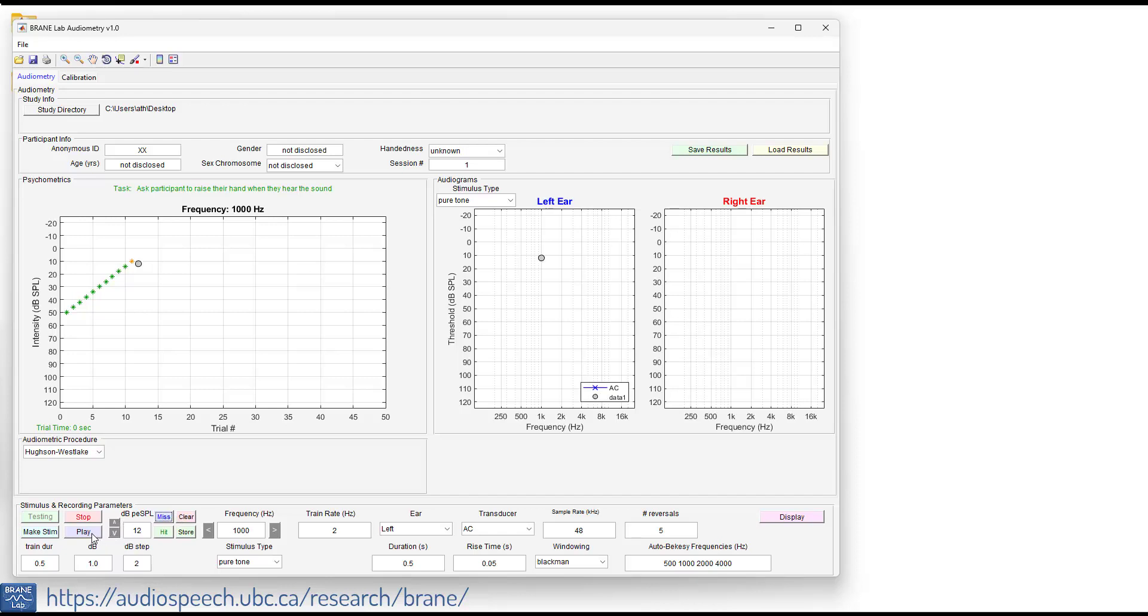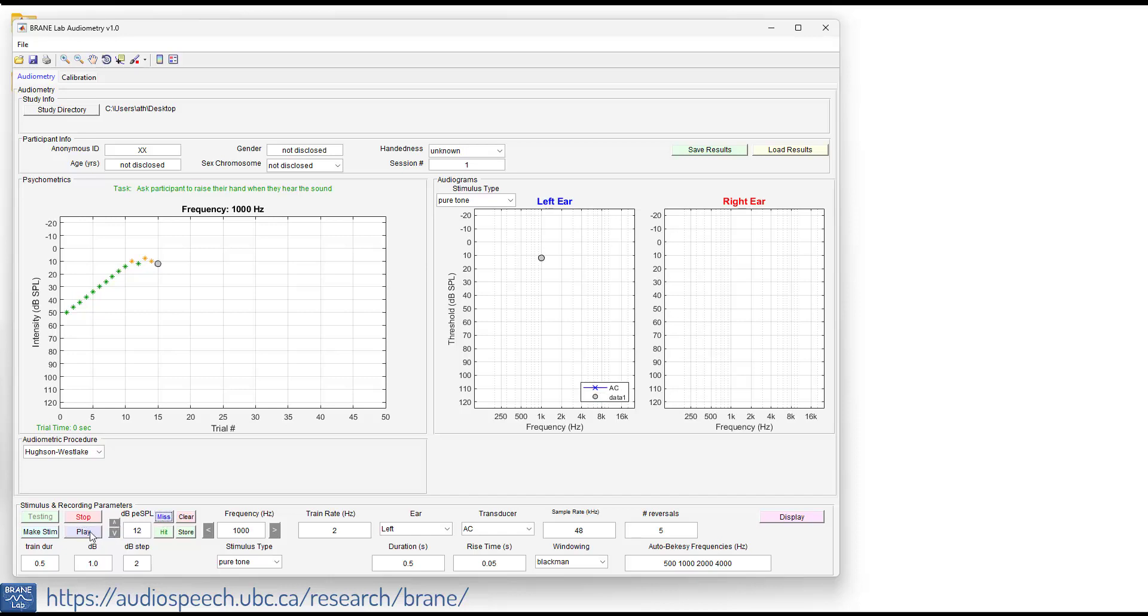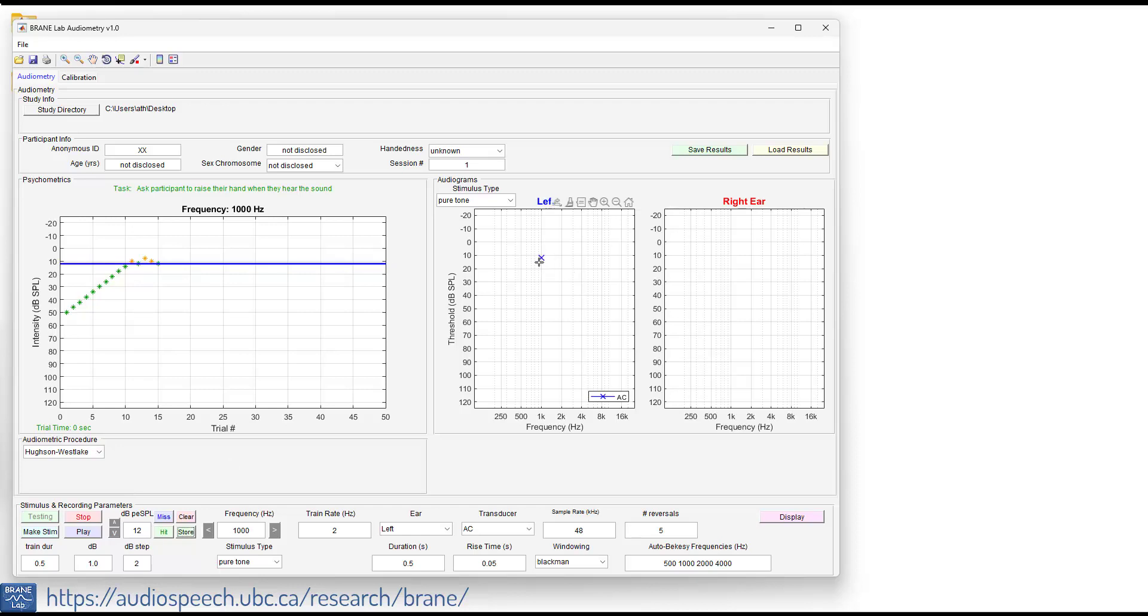We'll go up two dB. Yeah, I think I heard that one. So we'll go down two. Nope. Yep, I heard that one. So now that we've got two ascending out of the three, we're going to store that. And that stores it as threshold right there, as well as on the audiogram here on the left. And then we hit stop. So we get our test time. That took 102 seconds, a little longer because I had a lot of step sizes down.